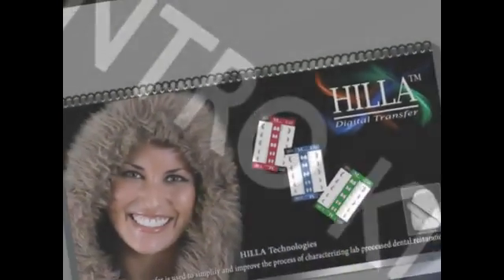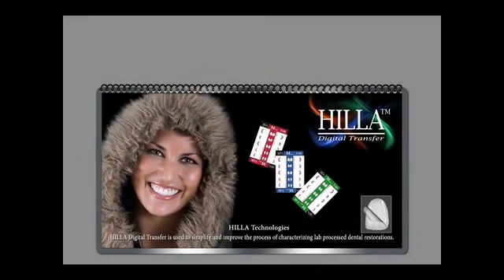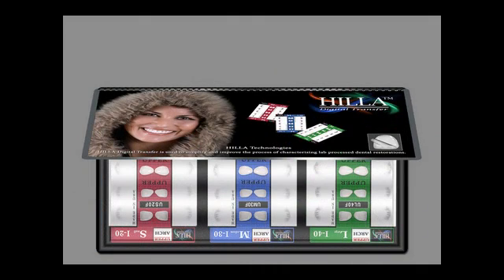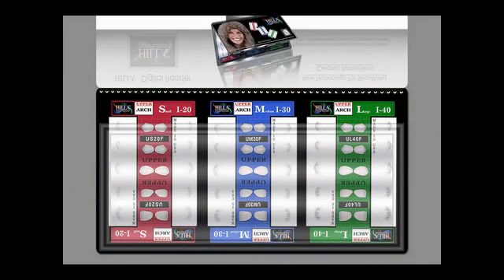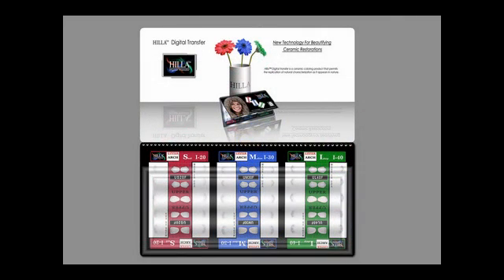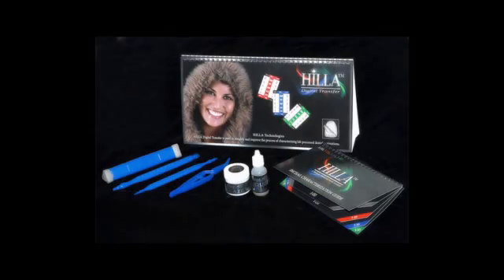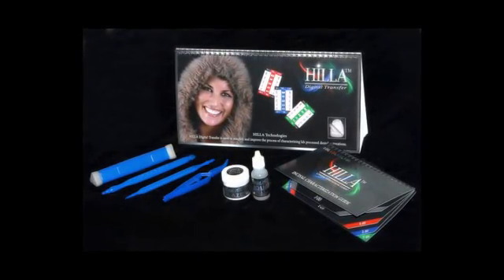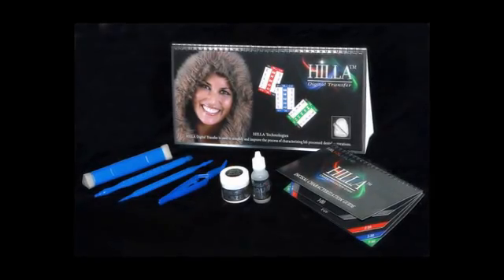If you have purchased the introductory kit, you will find nine Gila cards that represent the three levels of intensity in medium size for the maxillary teeth only. You will also find the toolkit, the Gila glaze kit, as well as the characterization guide.